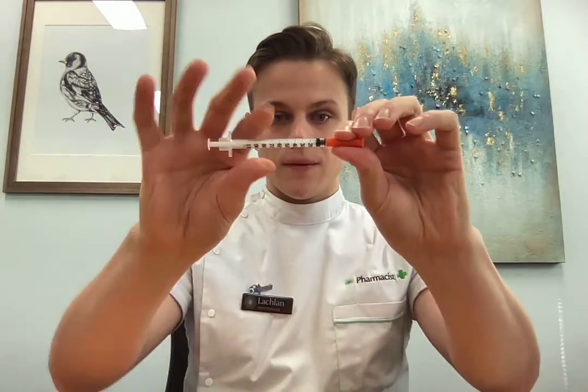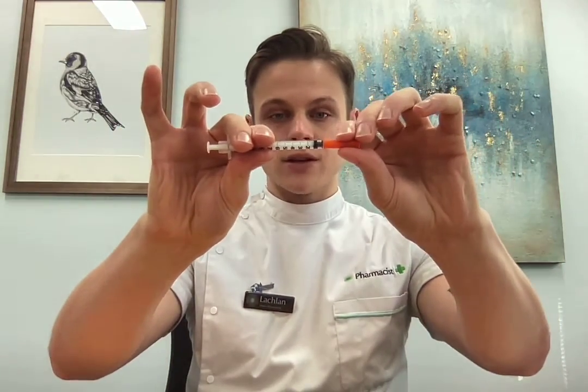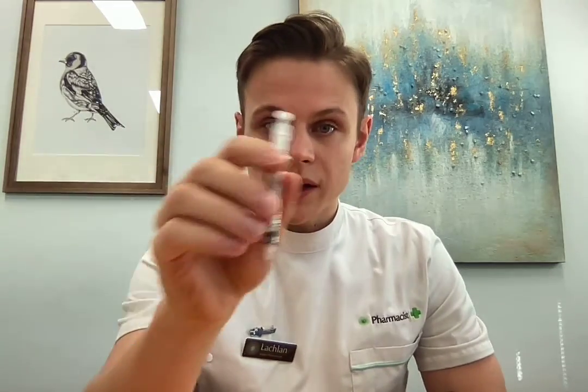With the syringe, hold it by the body and pull off the orange cap straight. Be careful not to rebound back because that's an easy way to give yourself a needle stick injury. That needle is incredibly fine and soft. It's important that any time you're pushing this into something, you go straight in and don't wiggle it around because you can really easily bend that needle.